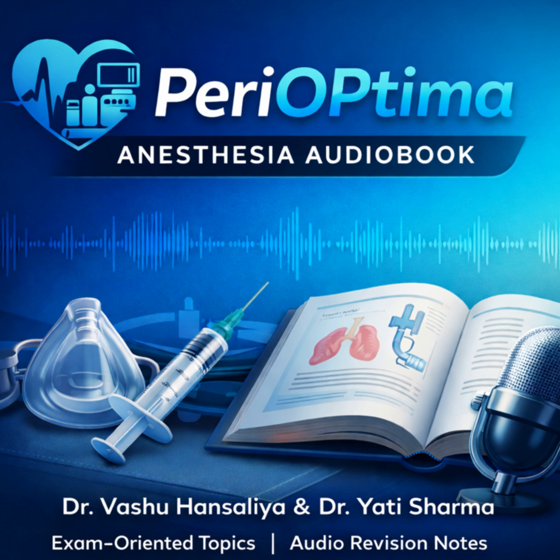And why does the site matter? Because the diaphragm recovers faster than the thumb, but the face recovers even faster than the diaphragm. So if you wonder if the diaphragm is paralyzed for intubation, you monitor the face, or orbicularis oculi. But if you want to know it's safe to extubate, you monitor the thumb. If the thumb works, the diaphragm definitely works. Brilliant nuance. That's a senior resident answer.